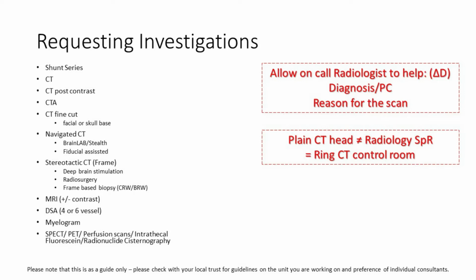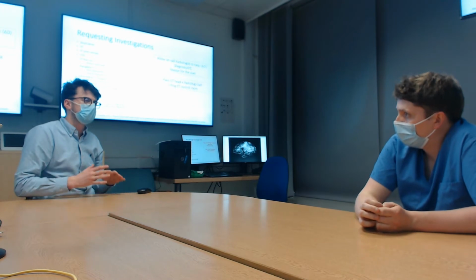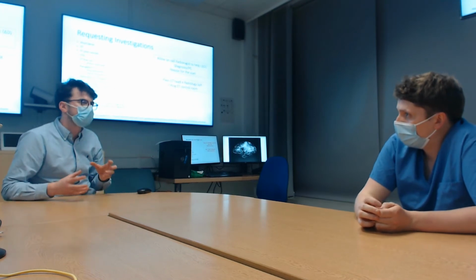So I thought it might be useful just to go through what we investigate, because we seem to request a huge number of images and different types of radiology, interventional radiology. I just wondered if we could start going through maybe some of those common ones. Yeah, so I think the most common is probably just a plain CT head.